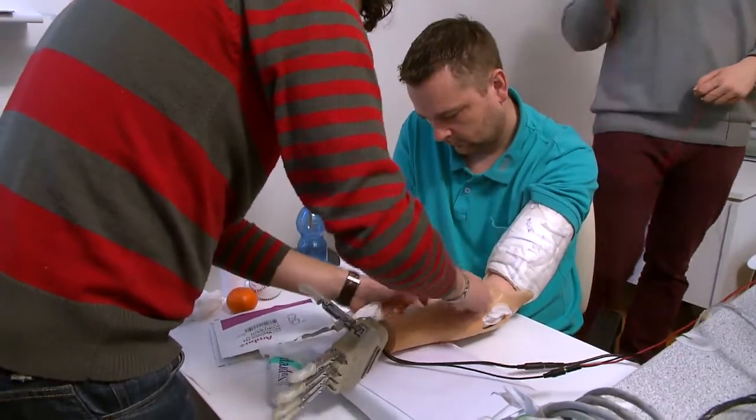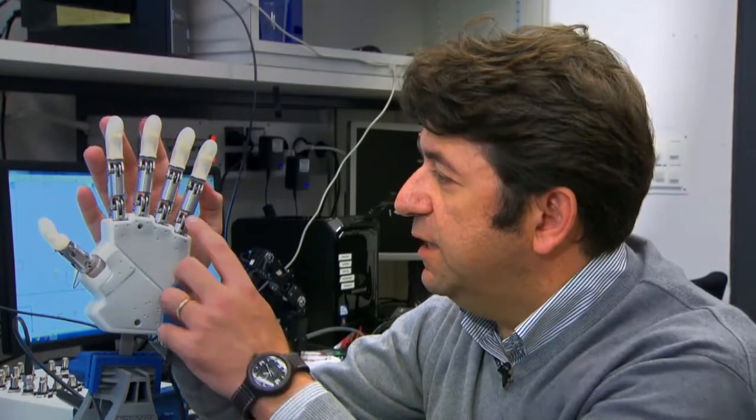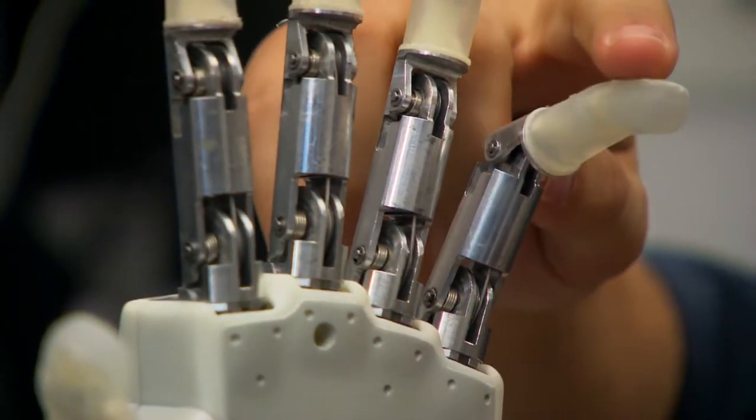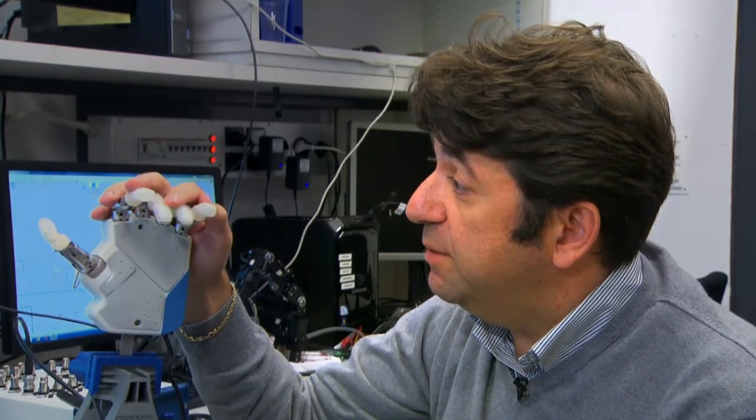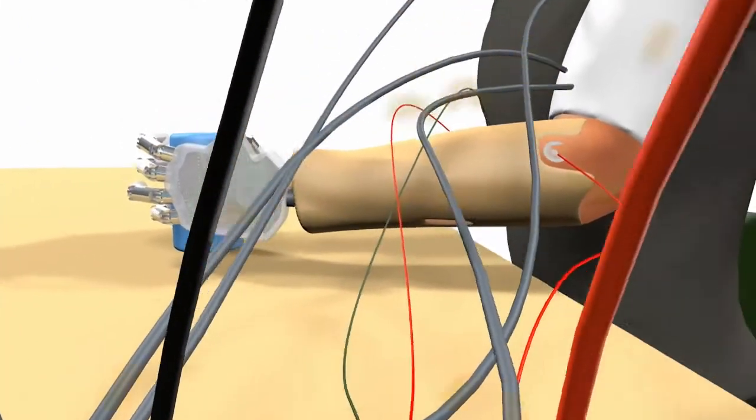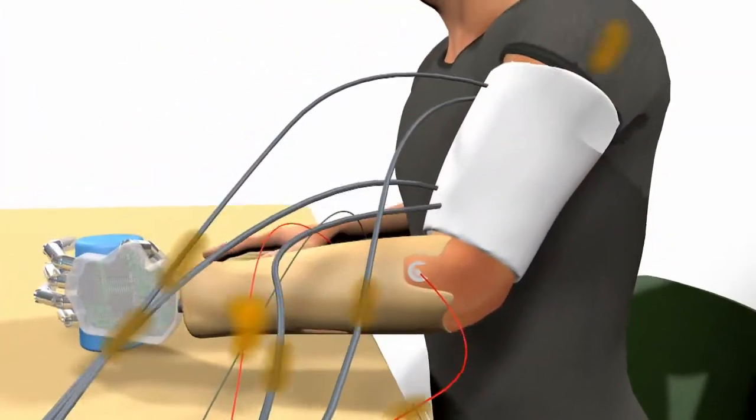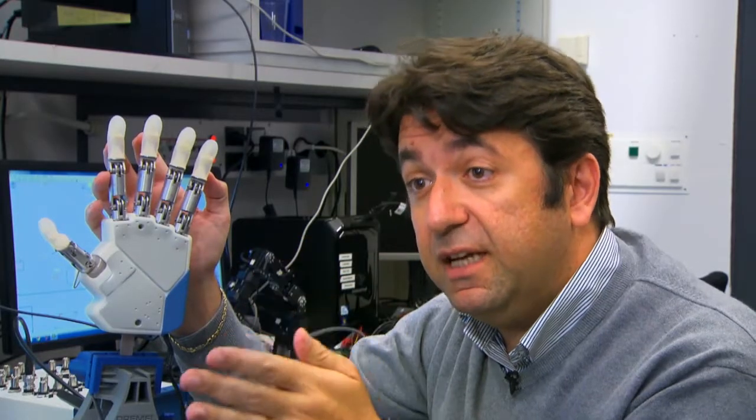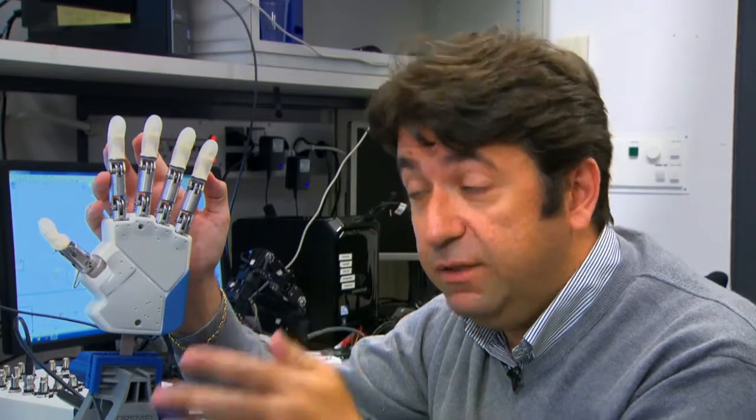The hand has several sensors attached to each tendon of each finger. We can use these sensors to understand the level of force the patient was performing while grasping an object. We use this force information to deliver very precise stimulation to the different sensory nerves in order to restore this real-time sensory feeling into the nervous system.